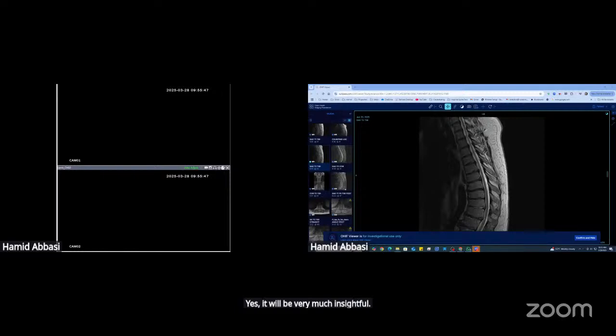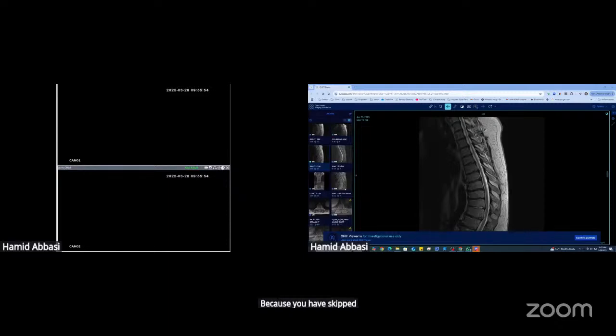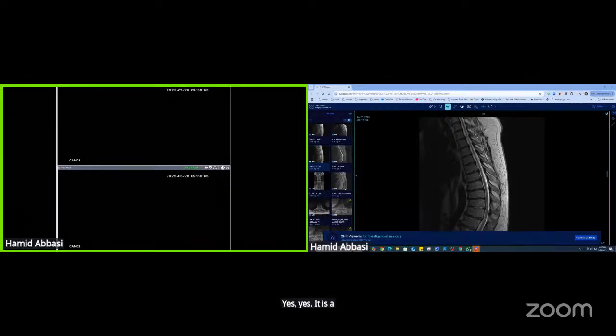Actually, you have answered my next two questions, because you skipped probably a level, and I also wanted to know which disc was creating problems. So you already did some discography before the procedure. This is a routine protocol for thoracic.